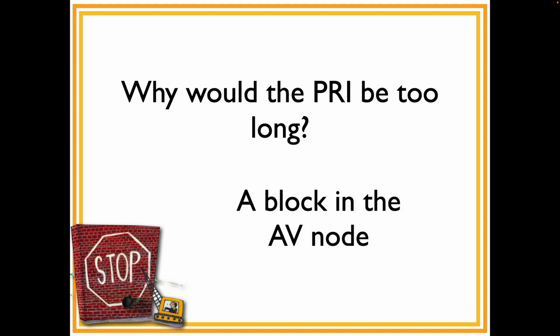For strip 6, do you show where the P wave you're looking at is? Yeah, it's a little tiny inverted P wave, so it's the first inverted one. Then I think there's a Q wave there, and to me it looks like the PR interval is only about one box. Okay. It's a really small PR interval.